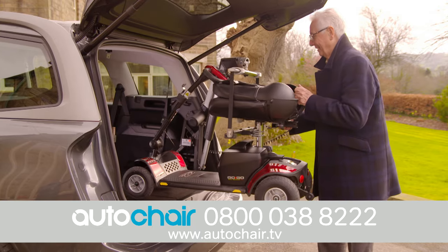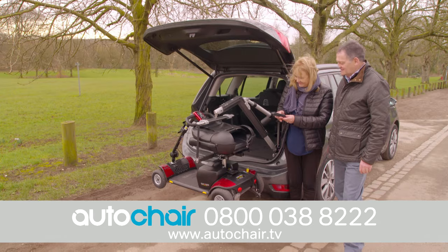Simply guide your scooter into the car and let AutoChair do the hard work. Enhance your mobility and independence with AutoChair.